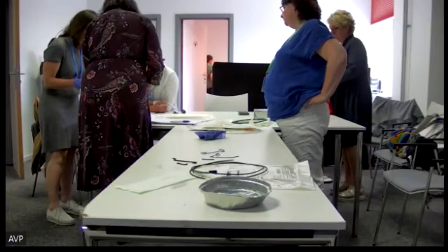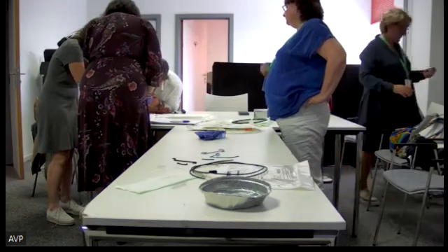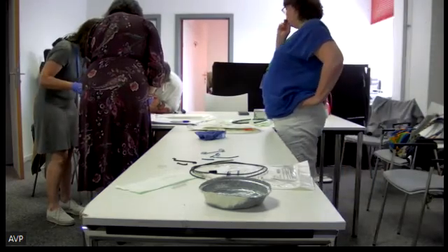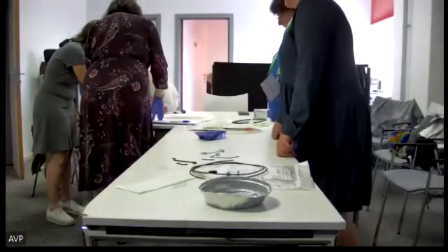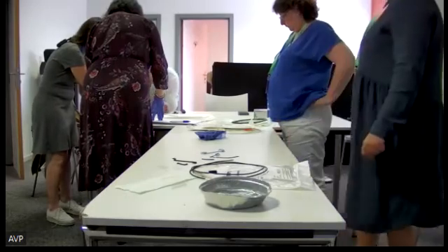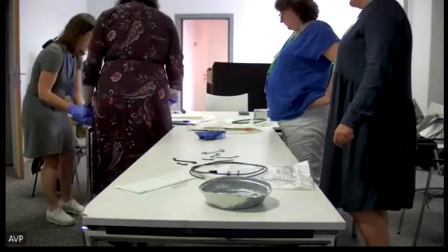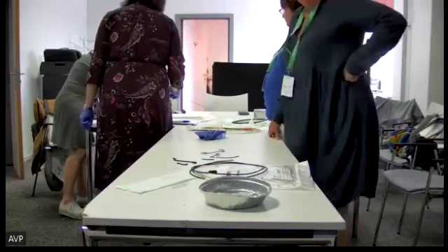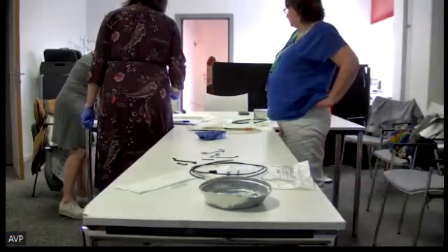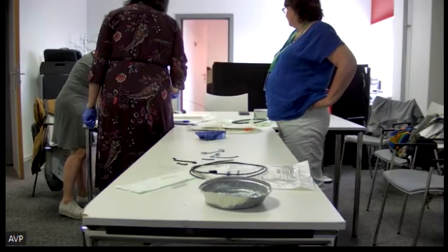This is the needle, and the sheath is outside. There's a stylet as well, and the needle. It's very difficult to see, but I bring back the stylet. The needle is beveled, but it's just a little hole. There's no design on the needle. It's just a sharp hollow tube, and the stylet is straight inside. So when you take out the stylet, it's like this.